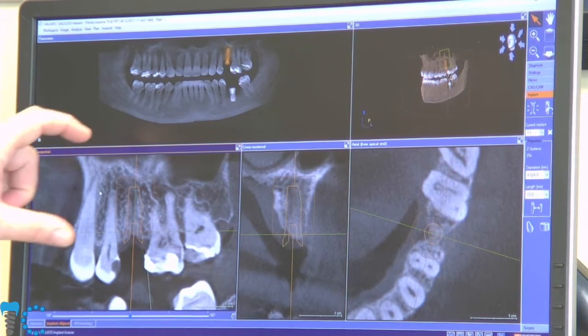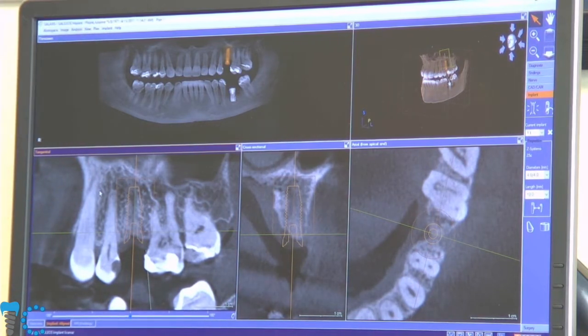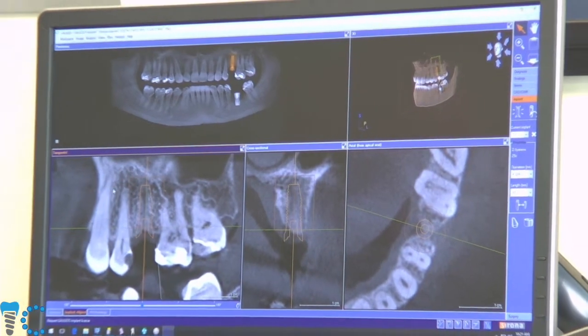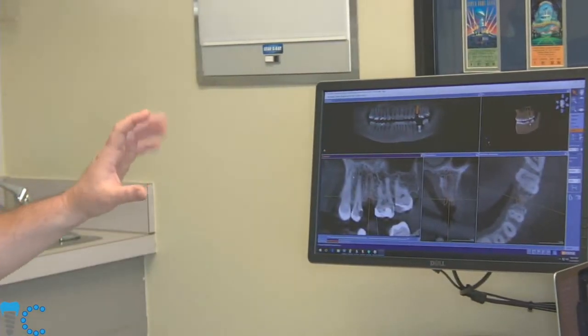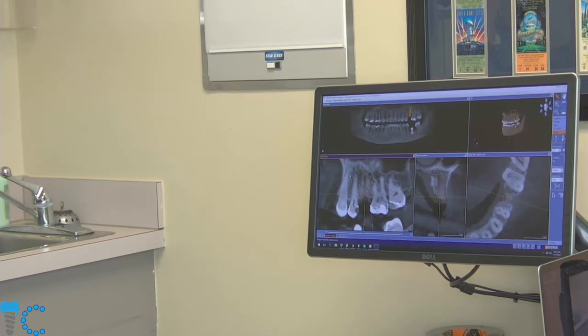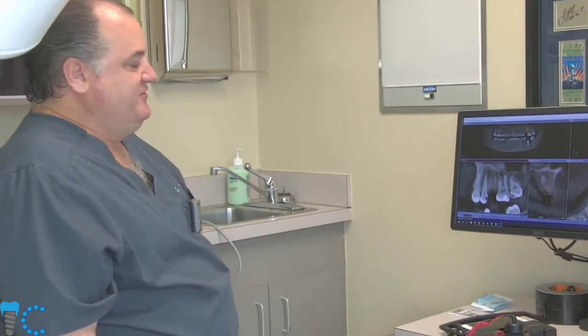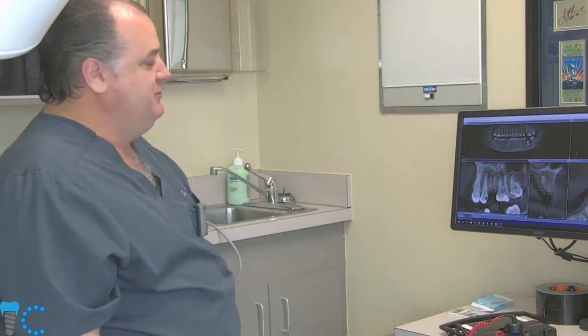The thing about using a 12 is that it gives us a little less buccopalatal angulation flexibility to match up the occlusion as well as we would like. And number two, if we decide we want to countersink the implant just a little bit to help us modify the emergence profile, it doesn't allow us the latitude to do that as easily. So again, I think a 10 millimeter length is ideal here. And if you used an 8 millimeter implant in this scenario, I think that would be absolutely fine. We'll give you an A+ on that also.